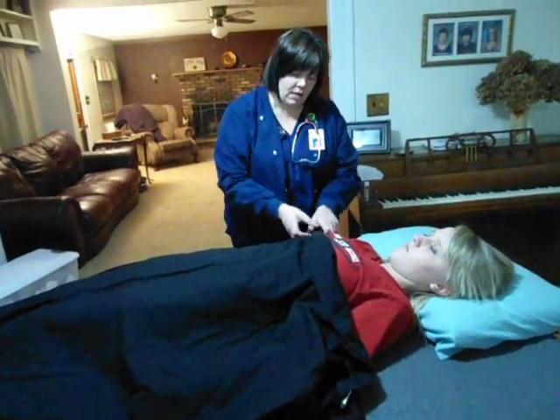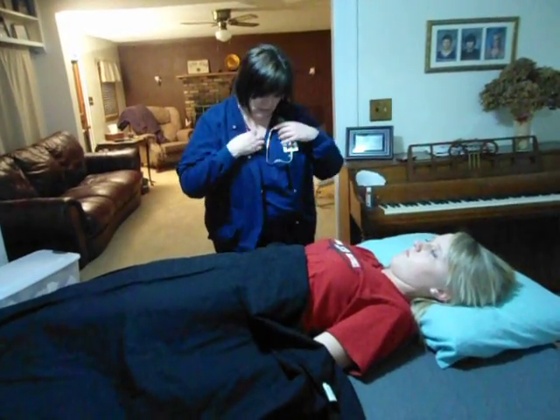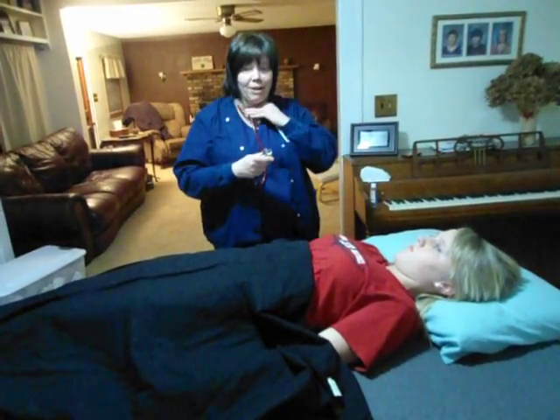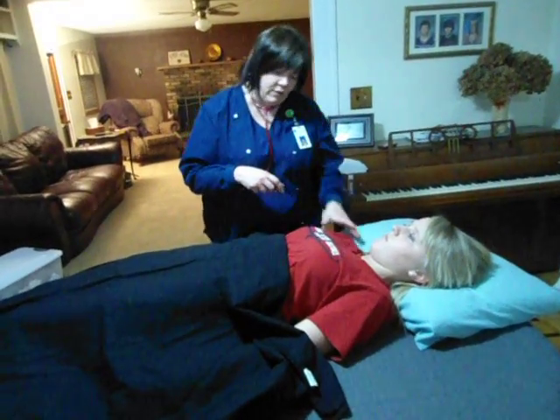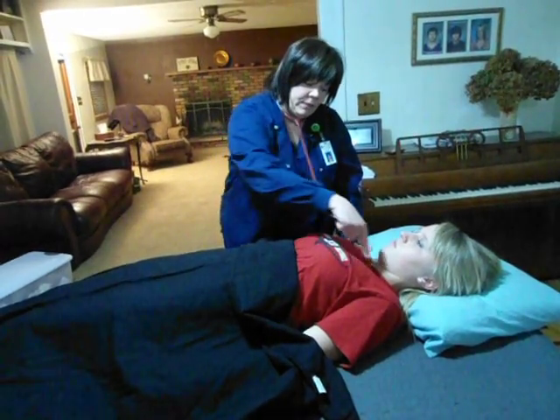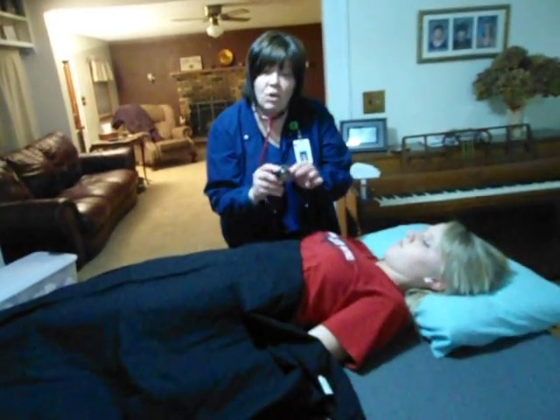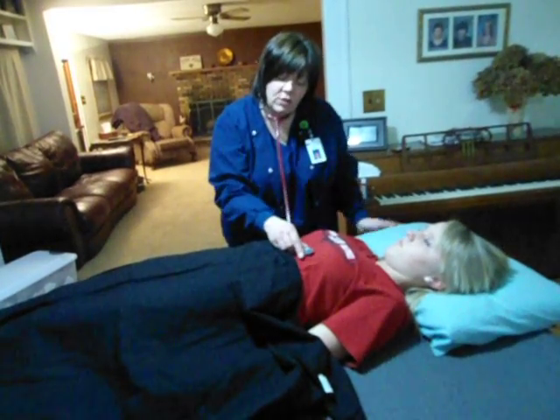And now we're going to come to the heart assessment. The first thing that I'm going to do is get my stethoscope ready here, and I'm actually not going to put these in because I can't talk and hear at the same time. But I'm going to assess her cardiac function, and I'm going to find the apical area again, and that's in the midclavicular line, 5th intercostal space. I'm going to be listening with the bell side because you can hear it better, and I'm going to have it on bare skin.